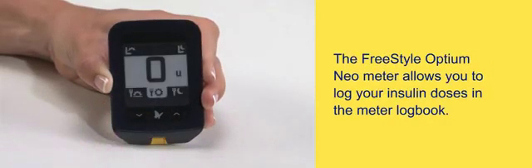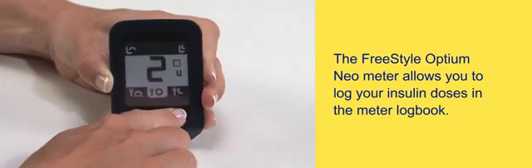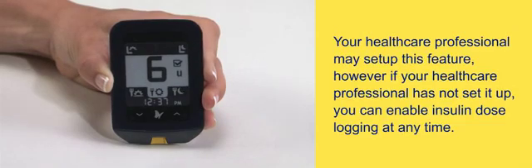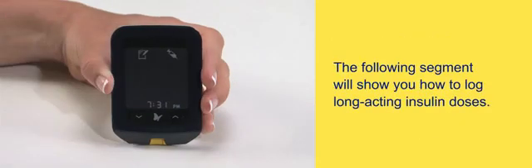The FreeStyle Optium Neo meter allows you to log your insulin doses in the meter logbook. Your health care professional may set up this feature. However, if your health care professional has not set it up, you can enable insulin dose logging at any time. The following segment will show you how to log long-acting insulin doses.